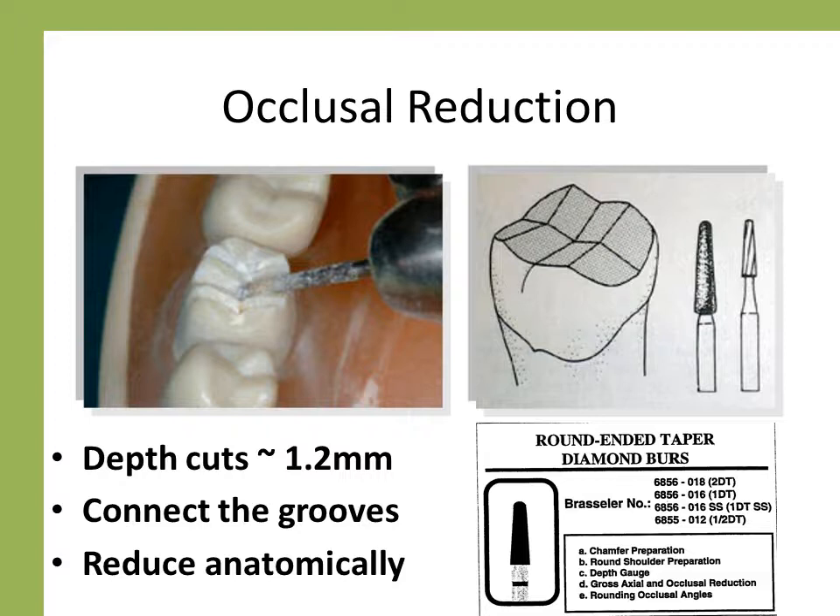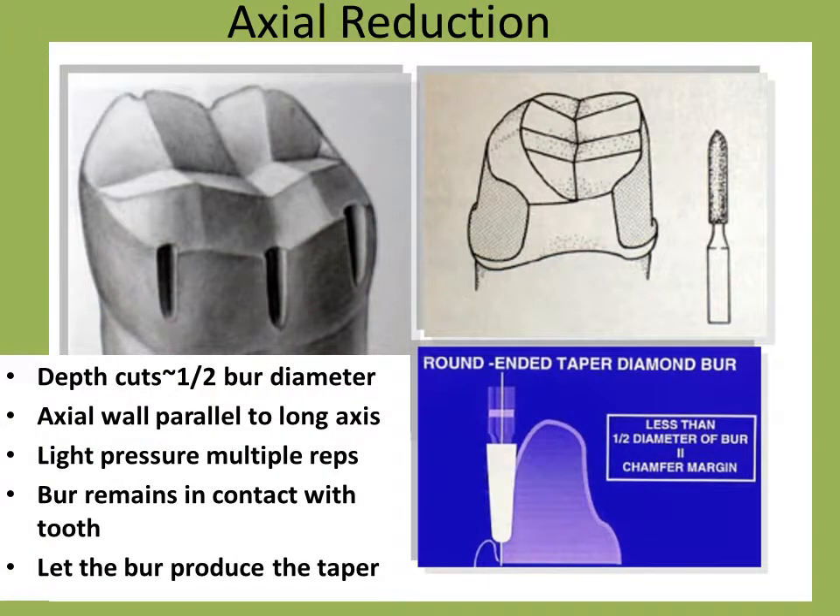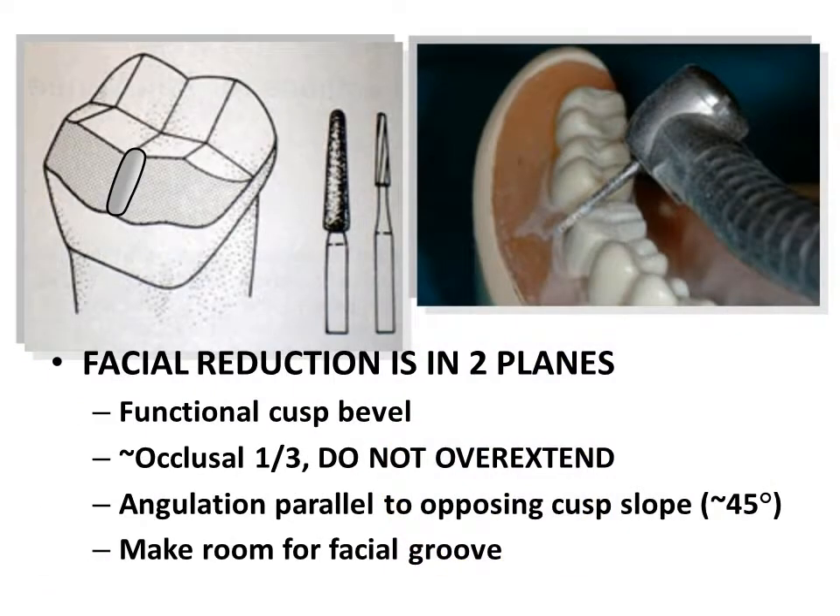Assuming retention and resistance form are adequate, slightly more reduction on the order of a half millimeter is not discouraged. After occlusal reduction, axial depth grooves are placed in the cervical two-thirds of the tooth and are about one-half the width of the 6856 burr. Keeping the burr in contact with the tooth and parallel to the long axis, connect the depth grooves. Light pressure and multiple sweeping movements of the burr will produce a smooth uniform surface of correct taper. The preparation is gently lowered to the desired location of the finish line. The chamfer should be less than one-half the diameter of the tip of the burr to prevent lipping. After reduction of the cervical two-thirds of the axial surface, the functional cusp bevel is placed. The burr is held parallel to the opposing cusps at about a 45-degree angle. Reduction should include space for the buccal groove and is sufficient to allow room for the restoration in all excursions.